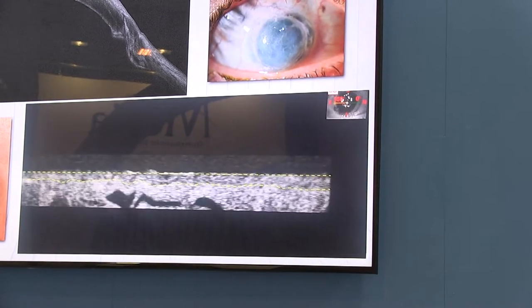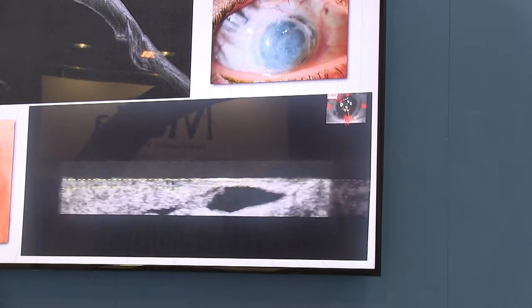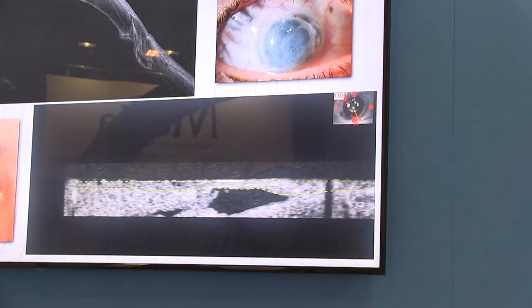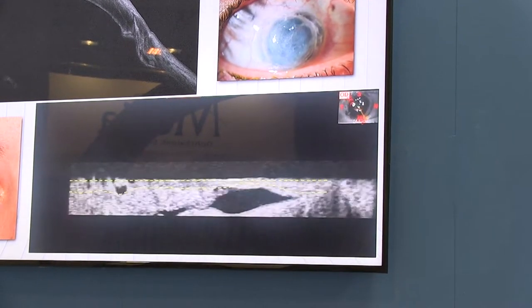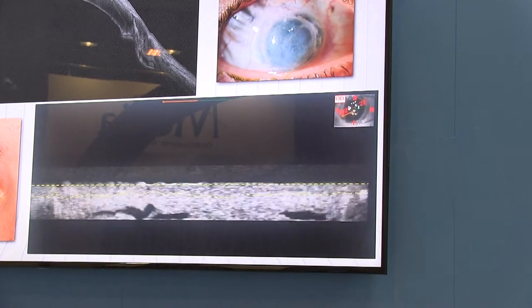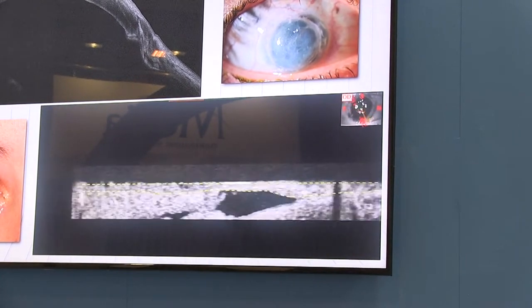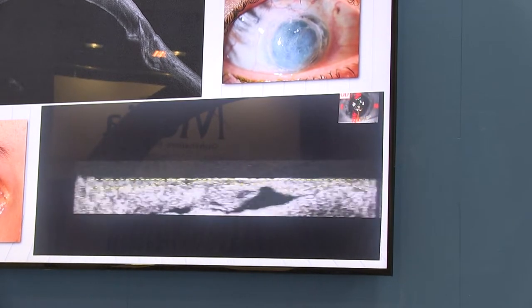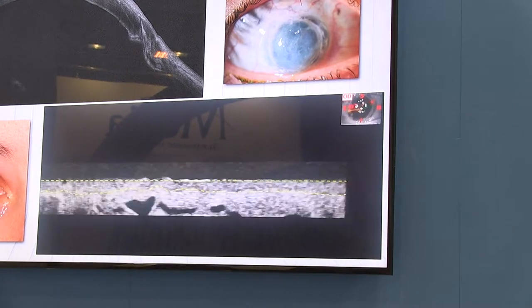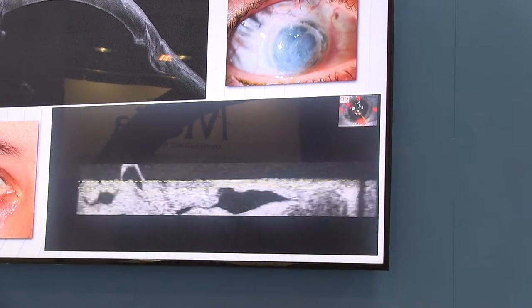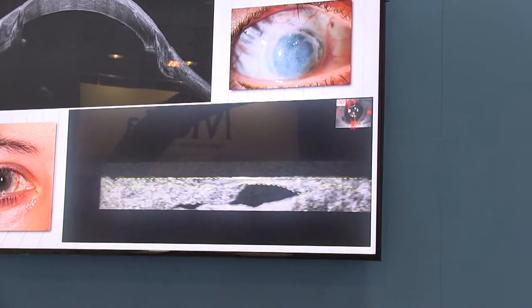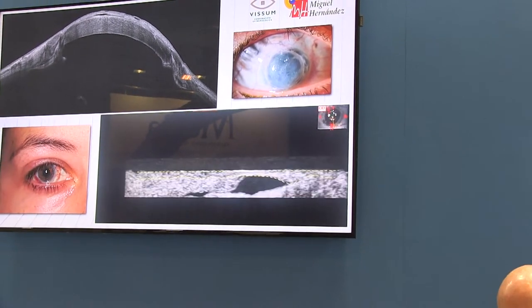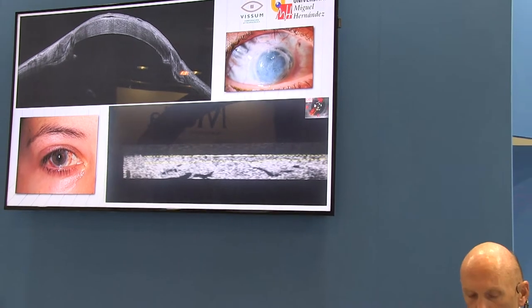This explains why this patient had fluctuating corneal thickness, and why this fluctuating corneal thickness was in the absence of any corneal bullous keratopathy. There was no bullous keratopathy because the patient had epithelial thickening — this epithelial thickening was epithelial hyperplasia. Indeed, we had a decompensated cornea, but we had the combination with intrastromal vacuolization, which is a remarkable finding. I have never seen something like this. We have many cases like this, but this was one of the very first.